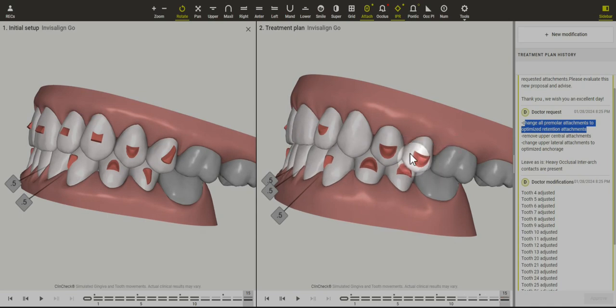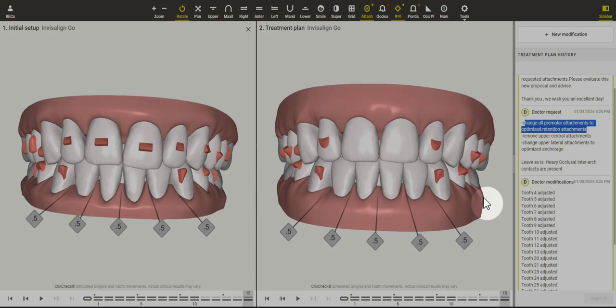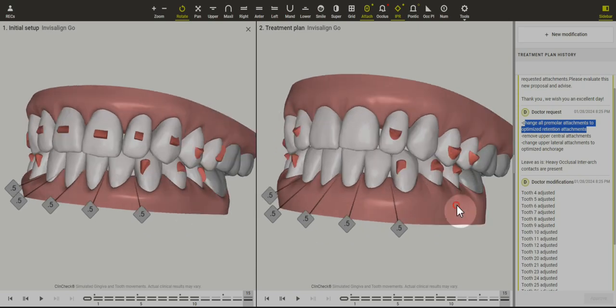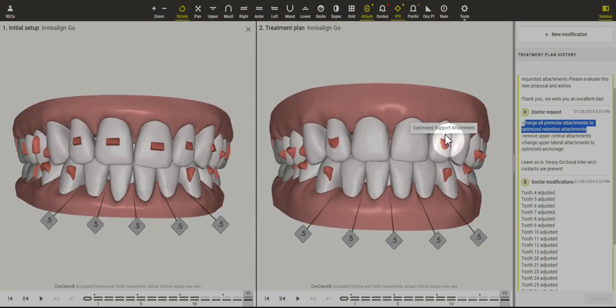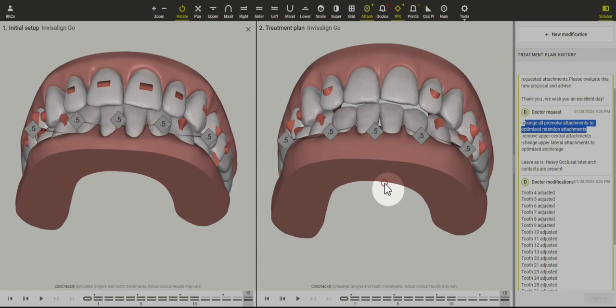We need to eliminate the premolar rotation movements to allow for this case to go predictably. If you were to approve it this way, the premolars may rotate a little bit but not completely, and you'd likely have your patient saying something like it doesn't feel very great in the back teeth. I love seeing these attachments on the upper laterals — fantastic — and still sticking with the same amount of IPR, but it gives us a better outcome.